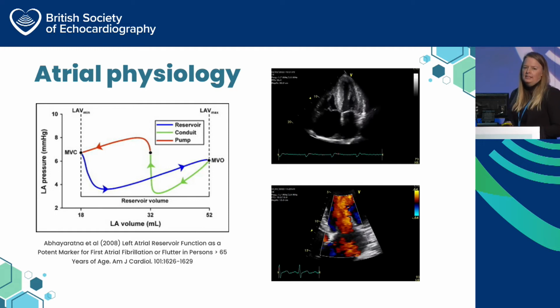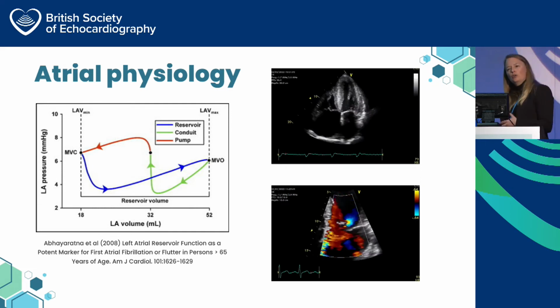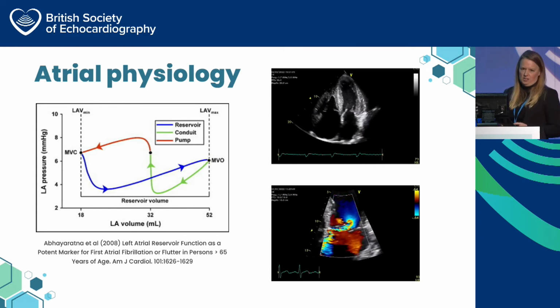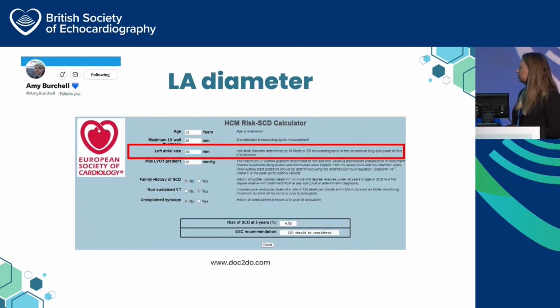However, that left atrium size is really only a barometer of left ventricular filling if there's nothing else going on that's making it dilate. So it is important to consider, for example, other pathology that could make that left atrium dilate, and that makes diastolic function assessment a bit harder. So just be aware of that in your practice.